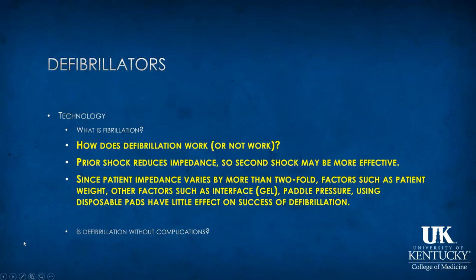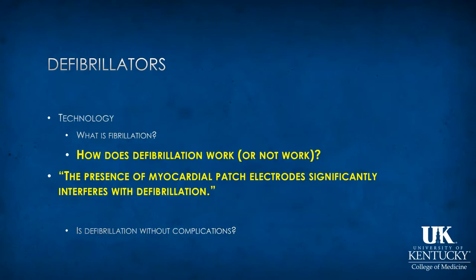As I mentioned, the first shock reduces impedance, so a second shock may be more effective. Now, since patient impedance varies by more than twofold, factors such as patient weight and other factors such as the interface, whether or not, how much gel is used, or whether or not reusable or single-use pads are used, and the paddle pressure have less effect on the success of defibrillation than patient impedance.